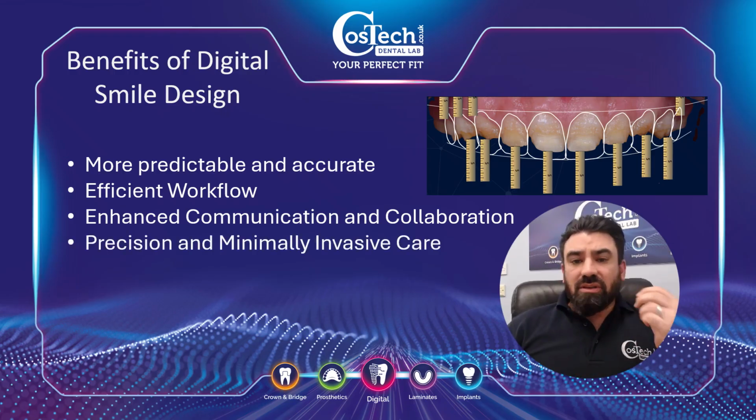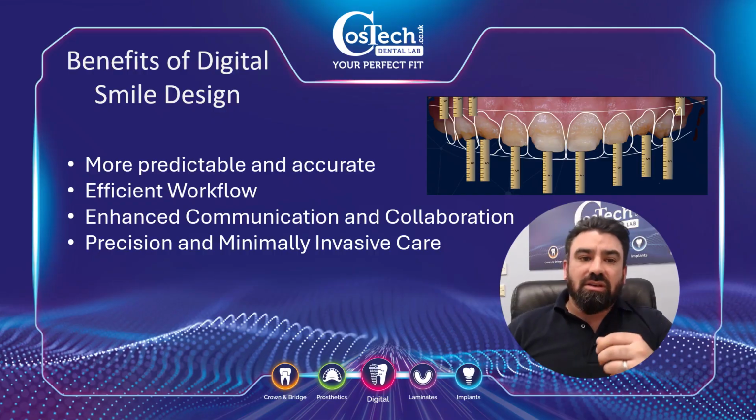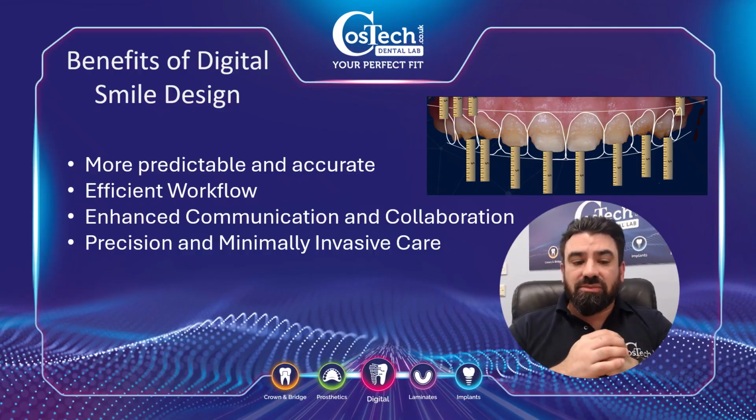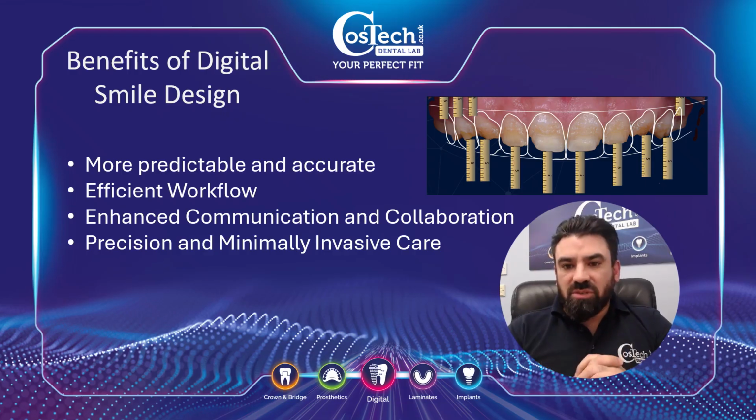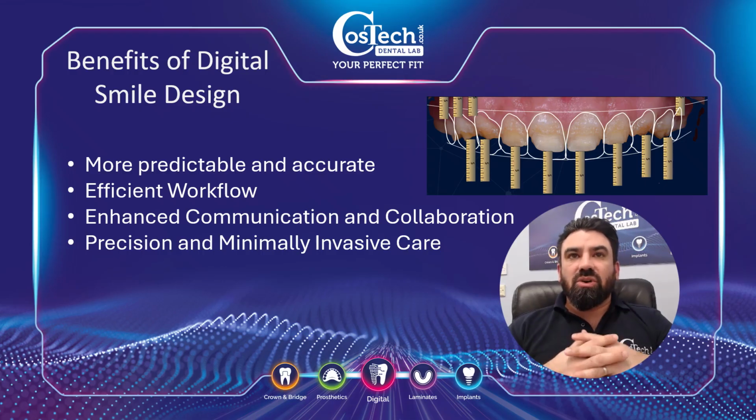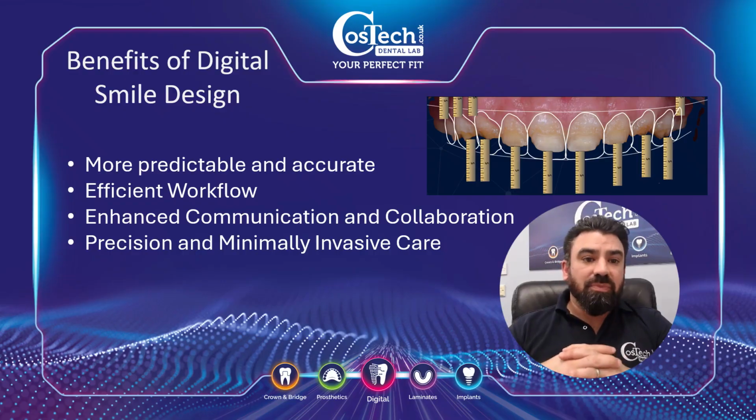So the other thing I mentioned earlier was with making everything minimally invasive, we want to preserve as much of the patient's natural dentition as possible. And this way we can actually work with a lot more fine parameters to enhance what we actually have.